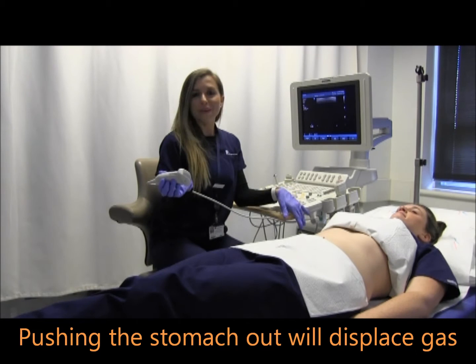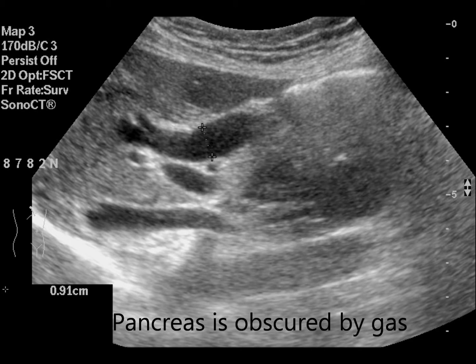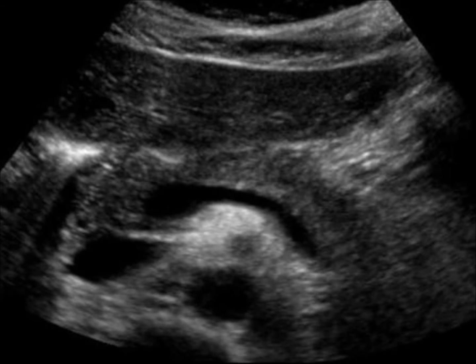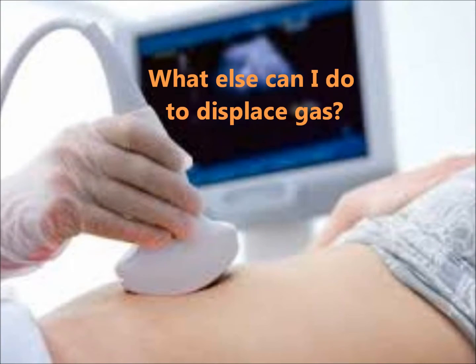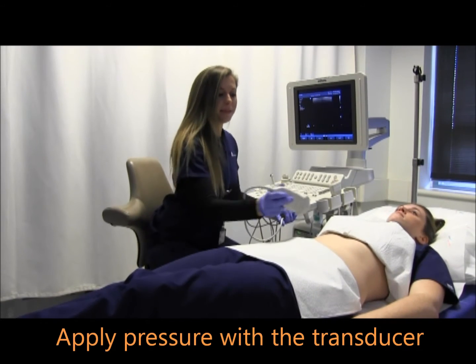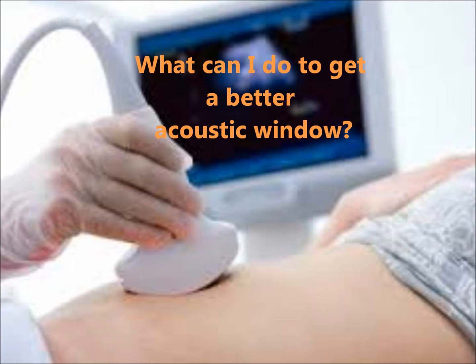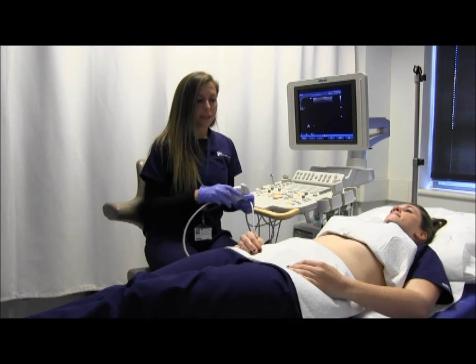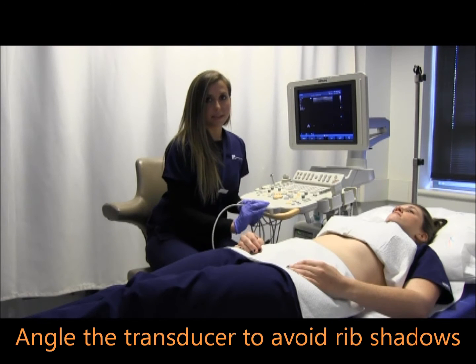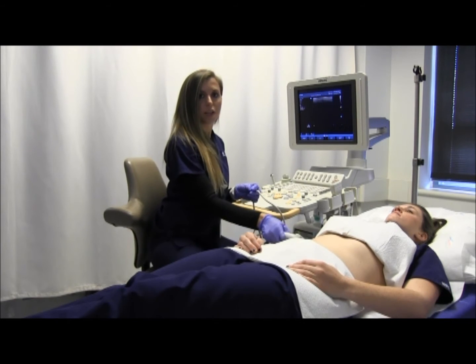You can also ask the patient to push their stomach out. You can also apply pressure to the abdomen to displace the gas. For organs located behind the ribs, you can do subcostal scanning or intercostal scanning. With intercostal scanning, keep in mind that there will be rib shadowing, and you angle the transducer to work around the rib shadow.